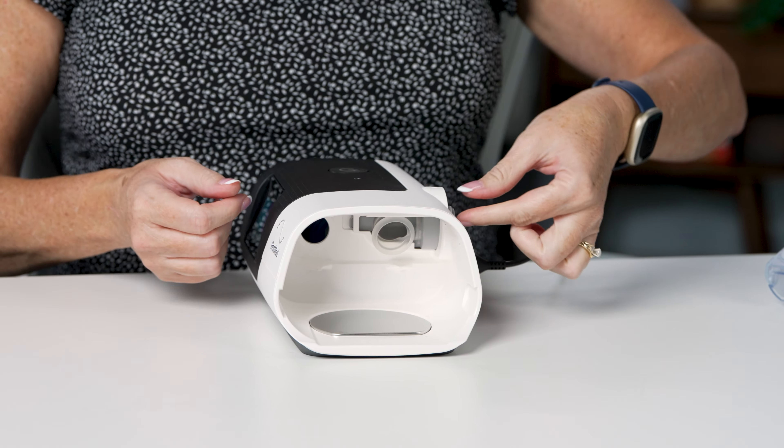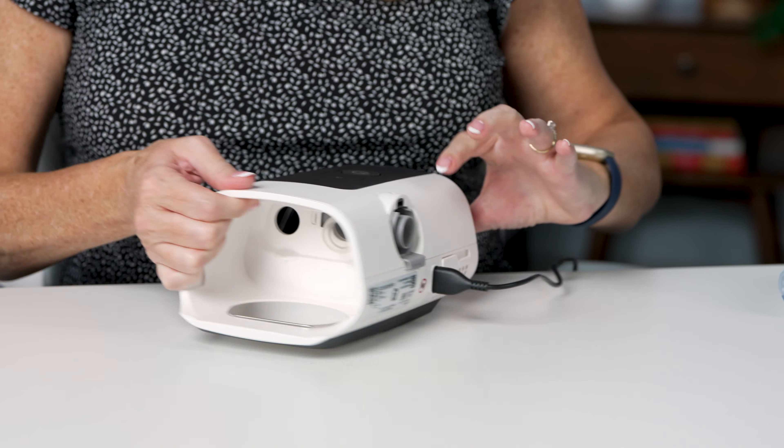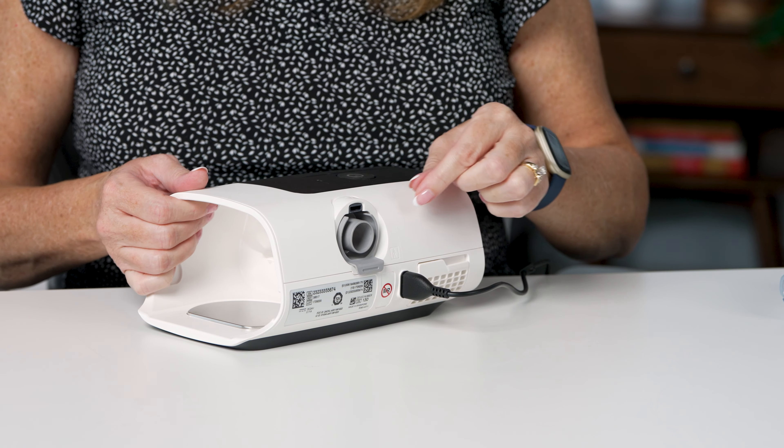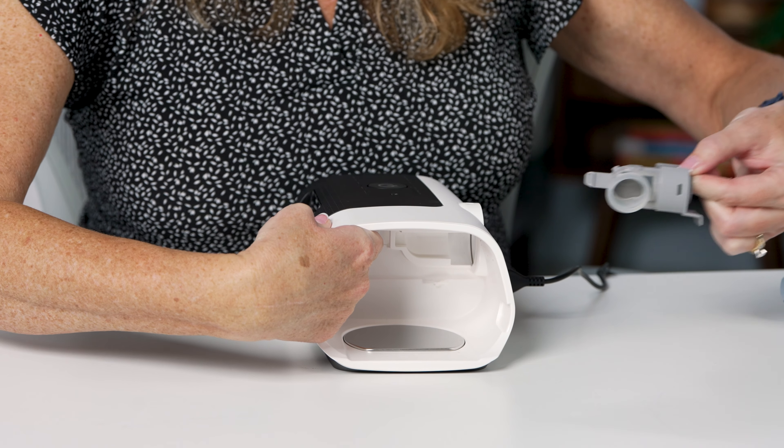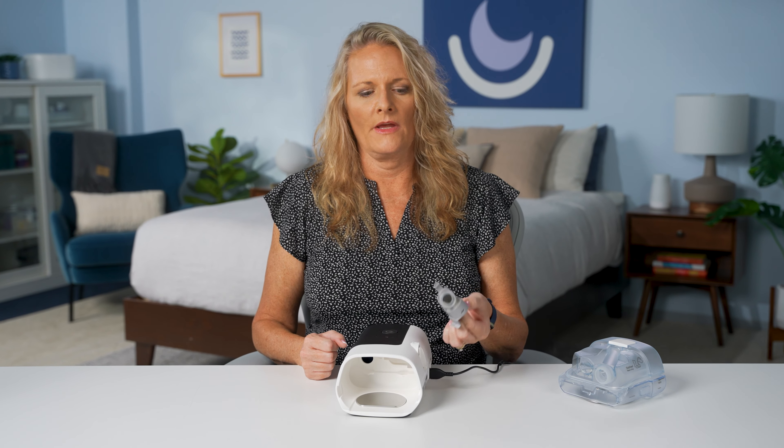What some of you may not know is that you actually have the ability to preheat your water chamber before you start your night. If you'd like that water warmed up so that your temperature is already set to what you'd like, hit the plus sign at the bottom of your menu and click on warm up. That will start the preheat setting on your machine for about 20 minutes to get that water ready for your night.